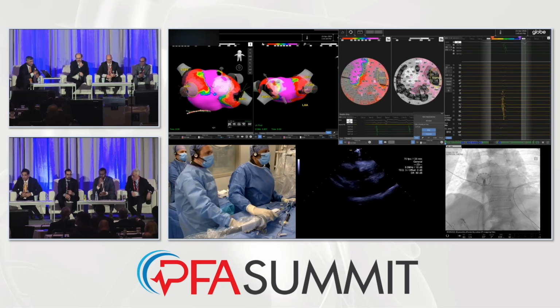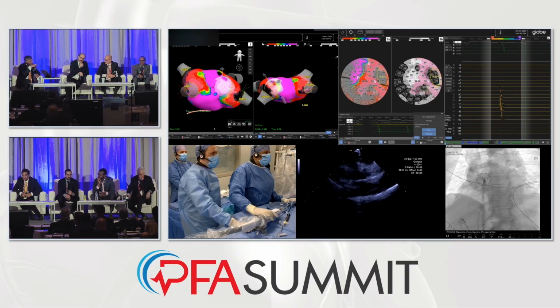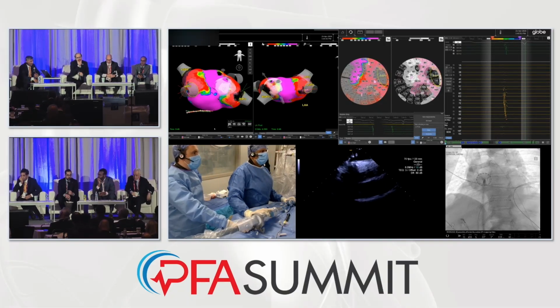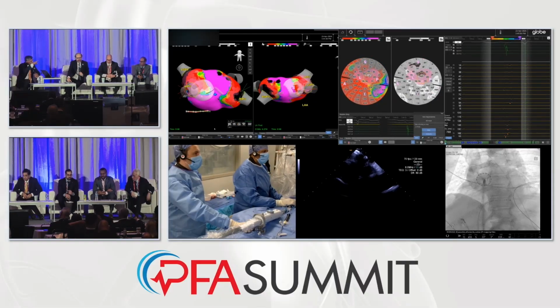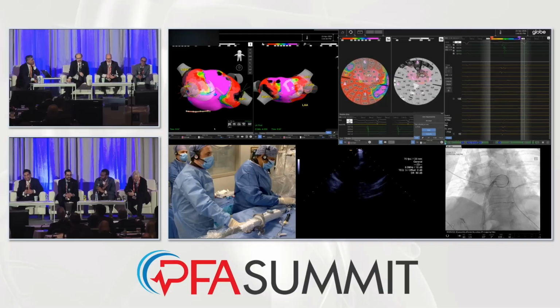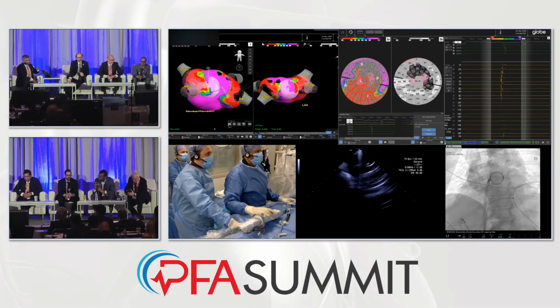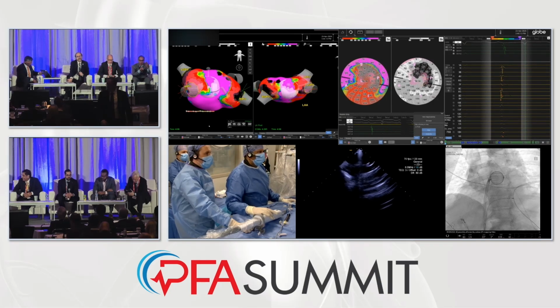The catheter itself does have a sort of front to it because the shaft is on the back end. So that's pointing in the general direction. It doesn't indicate force, so don't think about it that way. It's just pointing in that direction. Honestly, I forgot that it was there until somebody pointed it out. Is this some sort of true north marker? Yeah, like a true north marker, with the sheath, I think. So it helps to orient you once you start moving it around.